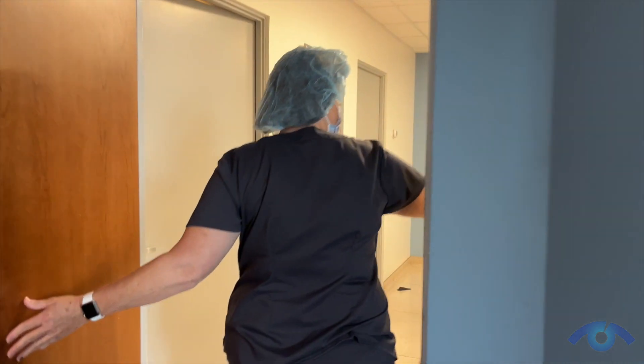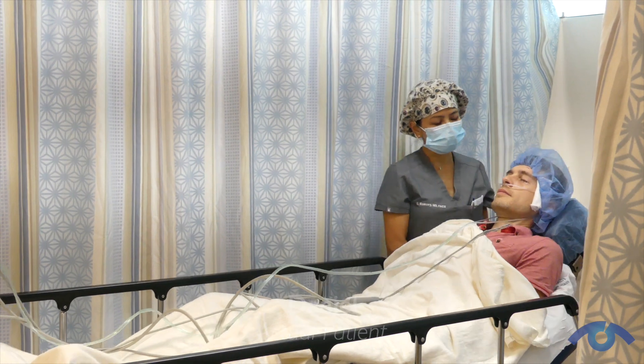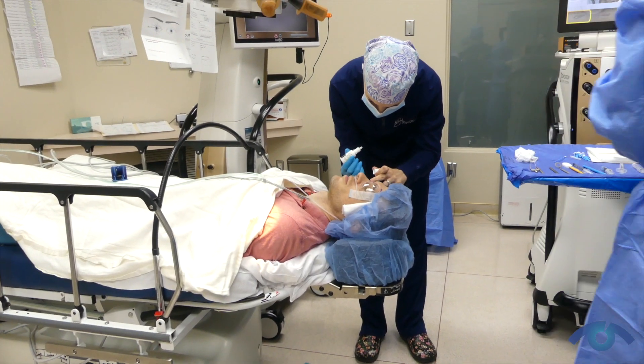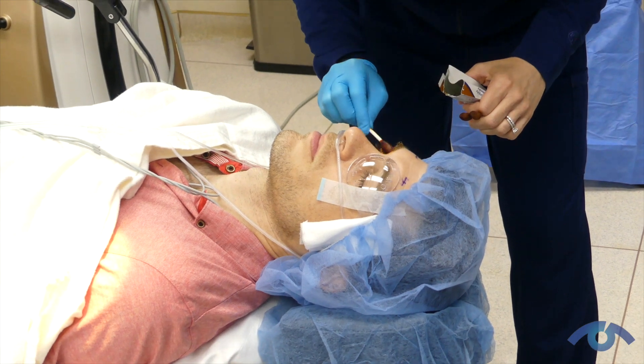The nurses will get an IV started. Most of that time is kind of waiting for your eye to dilate so that I can safely implant the lens in your eye. Once you get brought into the operating room, anesthesia will give you some medication to relax you — just enough to get you relaxed and comfortable to tolerate the procedure. It takes about 10 to 15 minutes per eye.